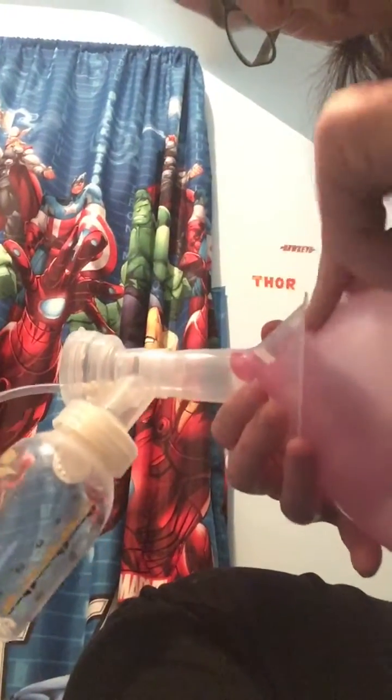Alright, cool. So we are good to go. My nipple is center in the tube. So then what you want to do is take your pump and turn it on. And there it goes. Okay.